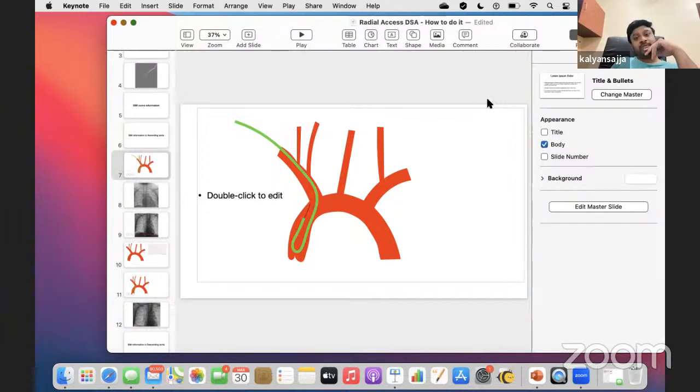I've been meaning to publish it, but there's the Fubuki 043, right? Sometimes I just deploy the stent retriever through that. I just go past the occlusion, deploy the stent retriever, and then apply suction in the Fubuki and also in the bigger catheter, not the intermediate. Fubuki is the intermediate, and the 7 French Fubuki would be the bigger catheter, and we applied double suction and stent retriever at the site of the clot. That was giving me good results, but I don't have a lot of cases. This month we did about 4 thrombectomies. But yeah, that's where we are.